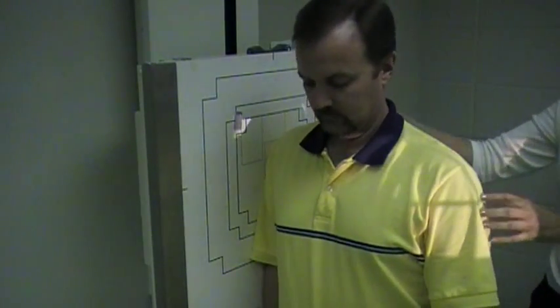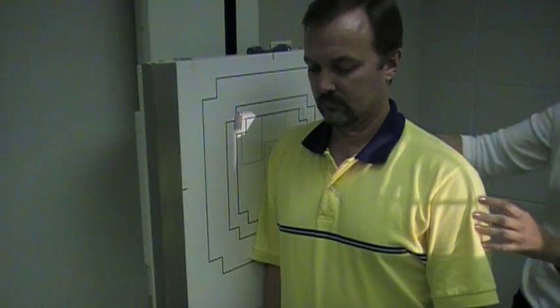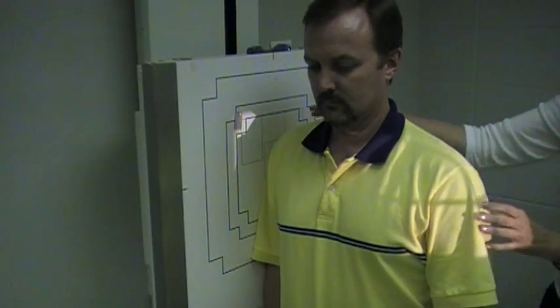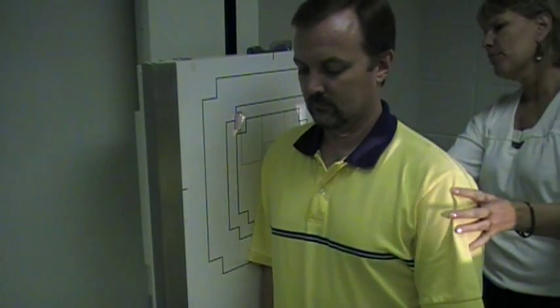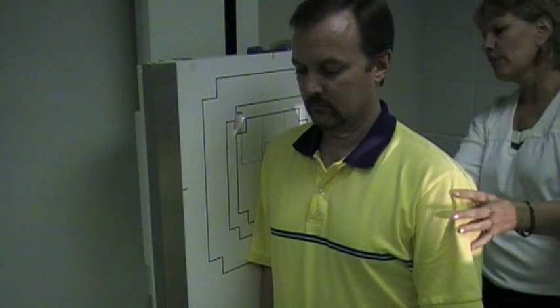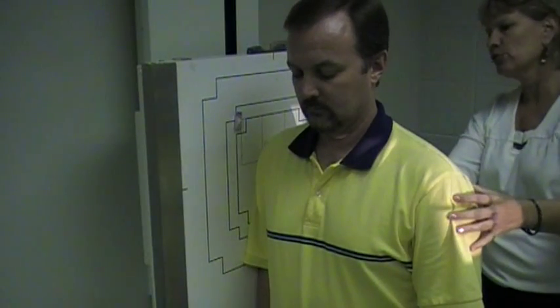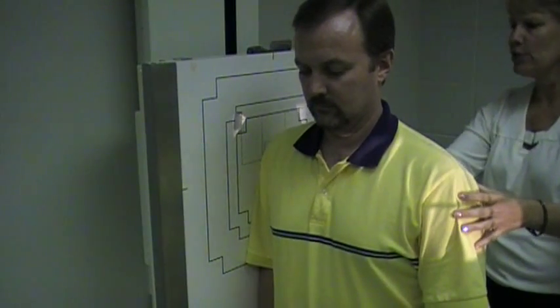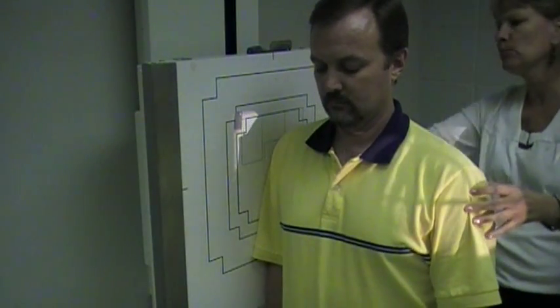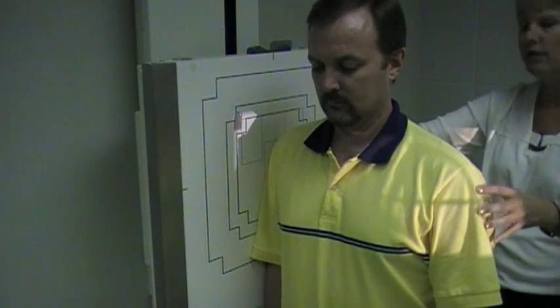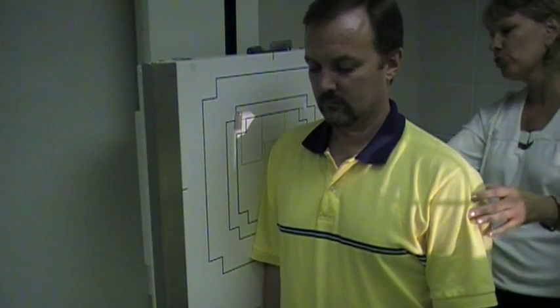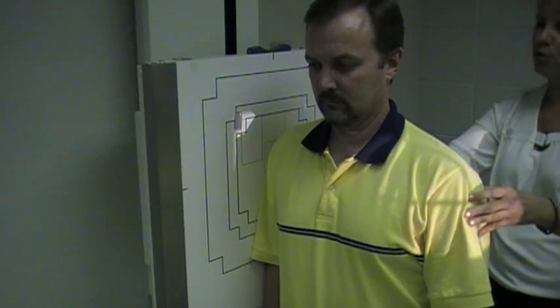We only need a 10 by 12 image receptor in lengthwise, and we're going to line up the body so that the surgical neck of the humerus is going to be approximately at the center point of our IR. So I have that portion of the arm right up against the board.